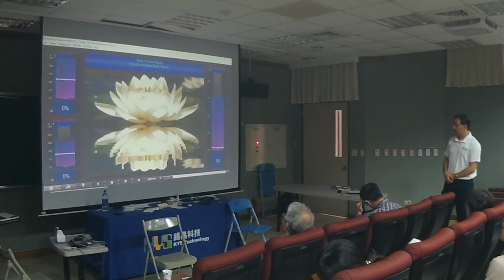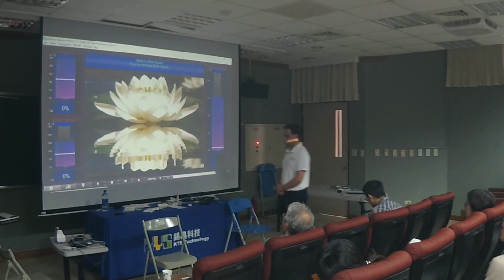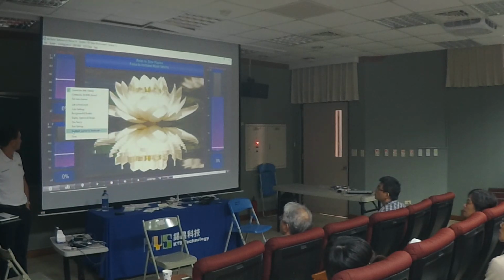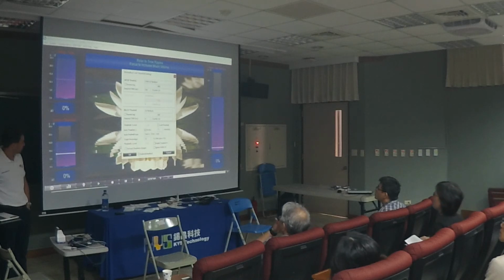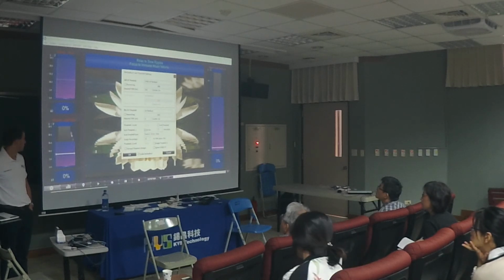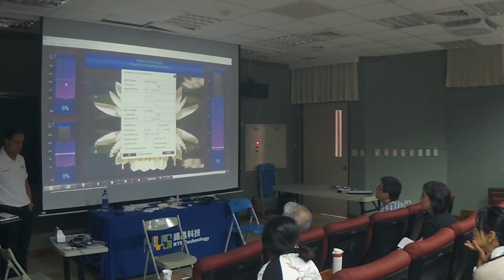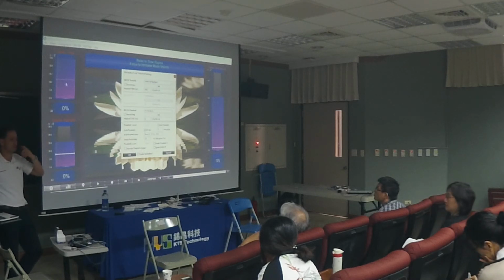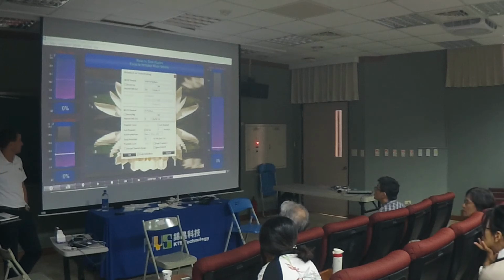Now, as far as the thresholds go, let's look at that. So you can do auto threshold, which is for the first 6 minutes, the threshold is going to move up and down automatically. I don't like auto threshold. I really don't. I don't see the point, and it can be very frustrating. The bar going up and down and the feedback going back and forth. I think it's too frustrating for the client. So as far as this goes, I would say off with the auto threshold.